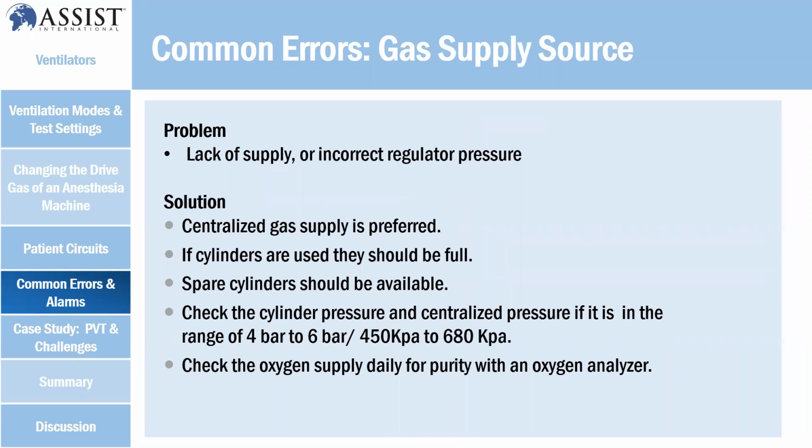Gas supply source, lack of supply or incorrect regulator pressure. So these are very common things that I see. When you talk about this type of issue, normally it is preferable to have a centralized gas supply, but we understand some places don't get this centralized system because it's too expensive.